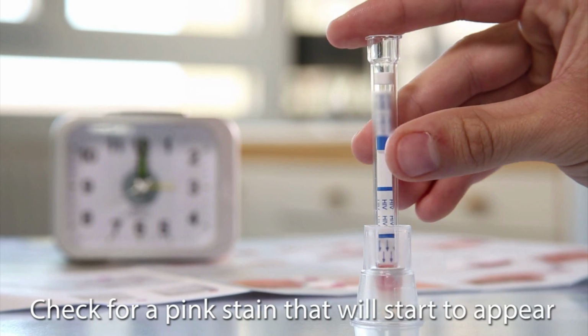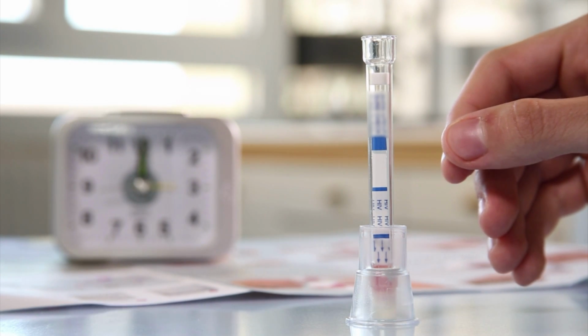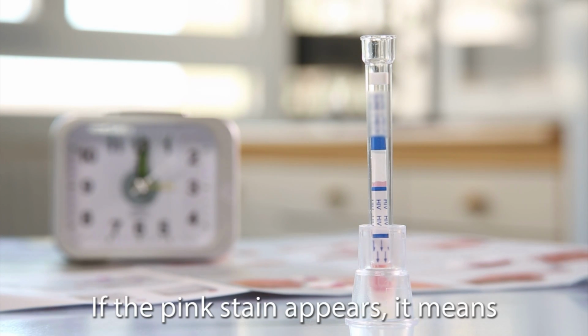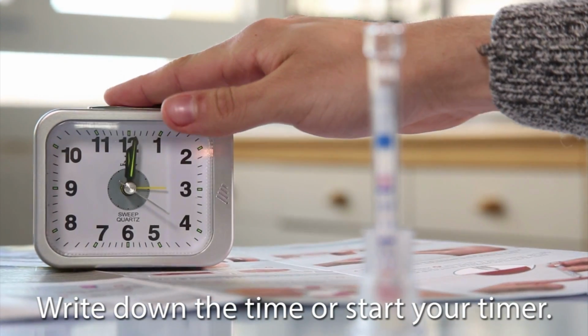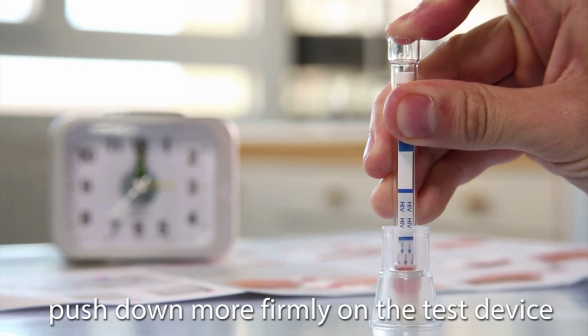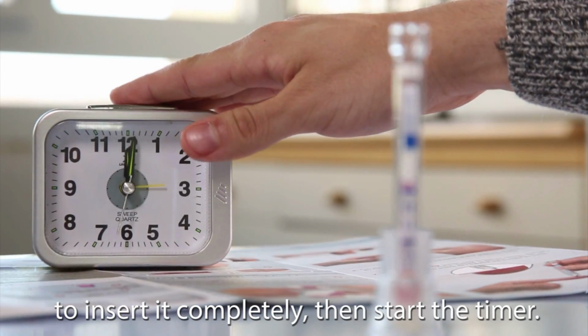Check for a pink stain that will start to appear less than a minute after the test device and buffer cap have been snapped together. If the pink stain appears, it means that your test is in progress. Write down the time or start your timer. If the pink stain does not appear within 1 minute, push down more firmly on the test device to insert it completely. Then start the timer.